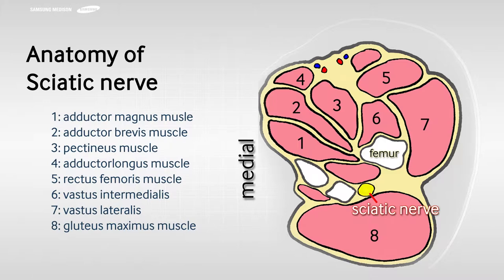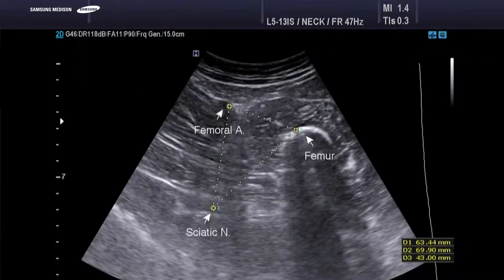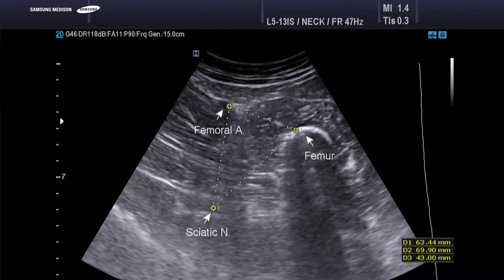The anterior approach to the sciatic nerve targets the nerve in the proximal thigh at the level of the lesser trochanter of the femur. This is an ultrasound image of the sciatic nerve.